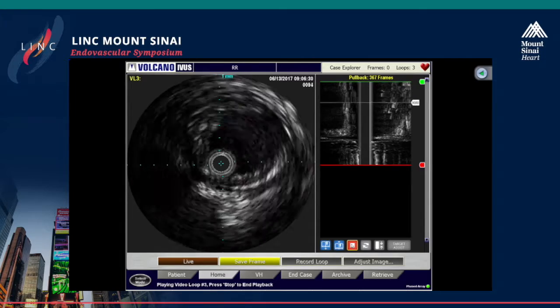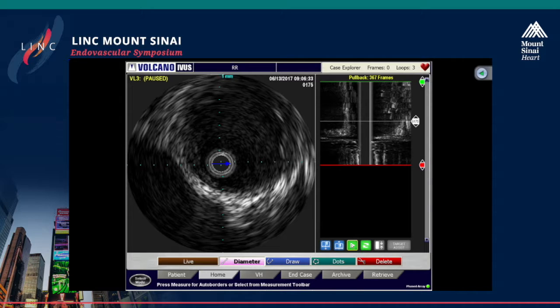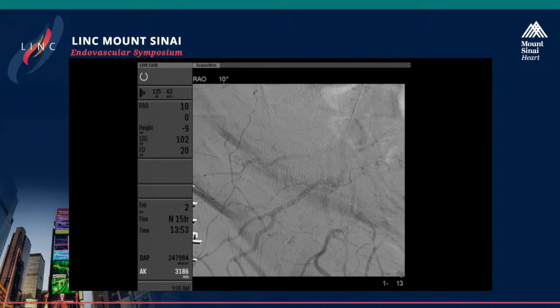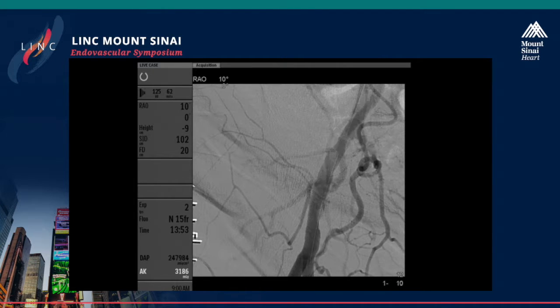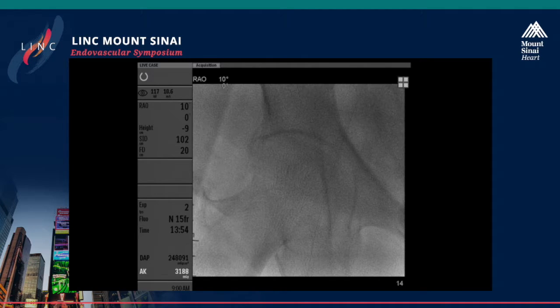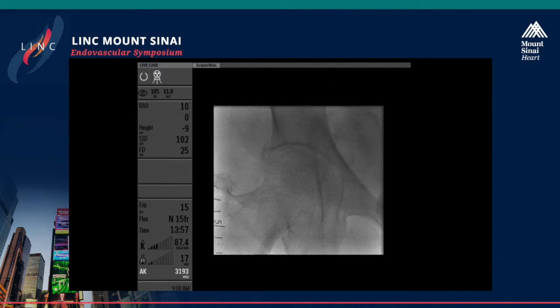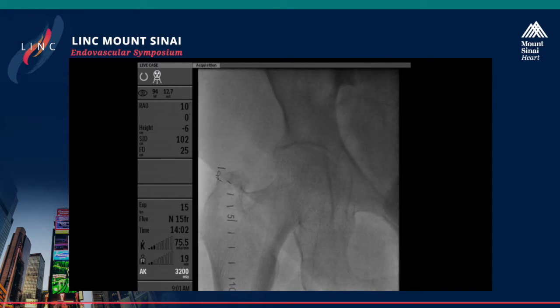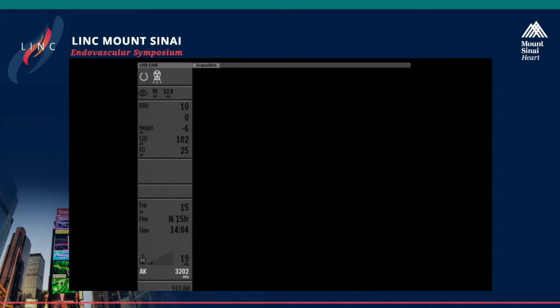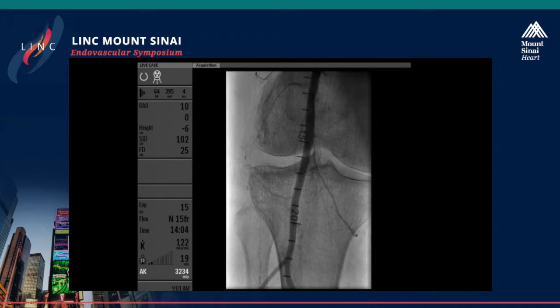Yeah, I think if you proceed and things become worse, it becomes harder, as you know, and if you stop now, I think it gives us options as surgeons, if we need to go back in, to really correct this without having a stent sitting in the way. It almost looks like she may have embolized at some point into the common femoral, because the rest of the vessels look pretty clean. So I wonder if she's had some embolic event in the past, or has plaque upstream or AFib or something. So no, there is a dissection. Whether that might represent the posterior tibial occlusion, because the vessels elsewhere look pretty beautiful. Yeah, so it could be that whatever's going on in the common femoral could have embolized to the PT as well.